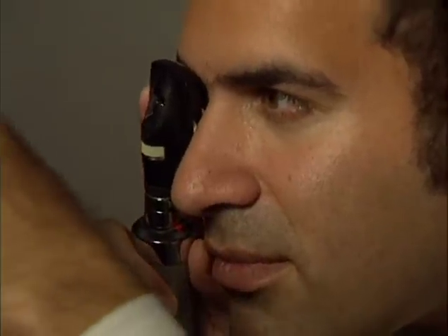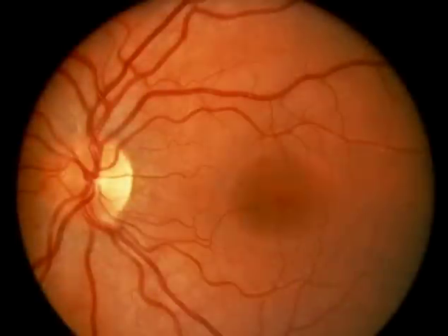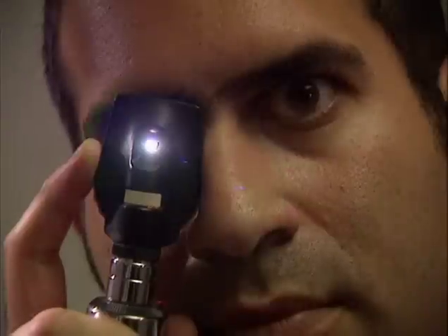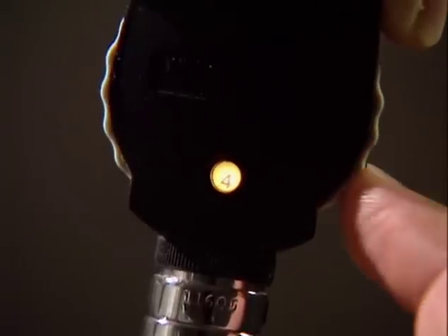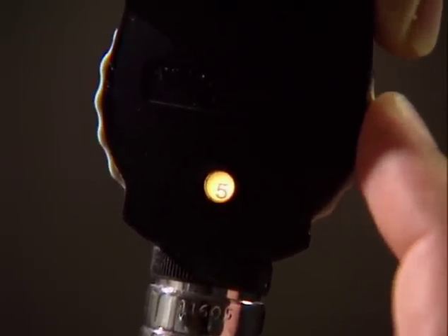If possible, keep both eyes open. Move closer to the patient. If you have difficulty focusing, close your opposite eye. You will only see a small portion of the entire retina through this ophthalmoscope. If you do not initially see a blood vessel, then slowly sweep around the fundus to find one. Find a blood vessel and try to keep that in view. If it's not clear, you can dial in additional plus or minus power to sharpen the image.